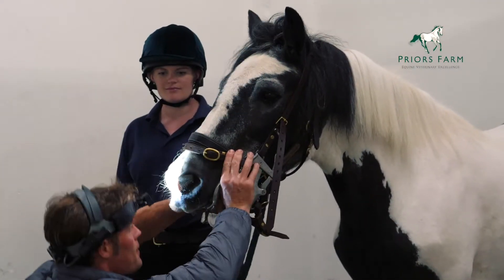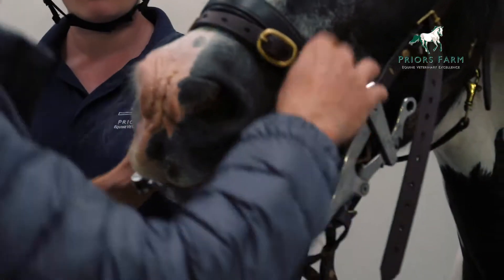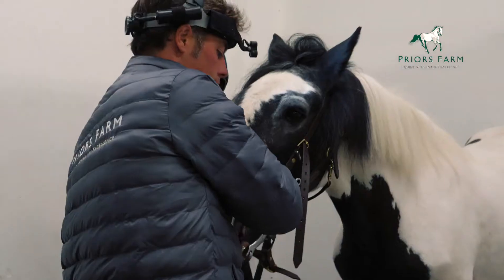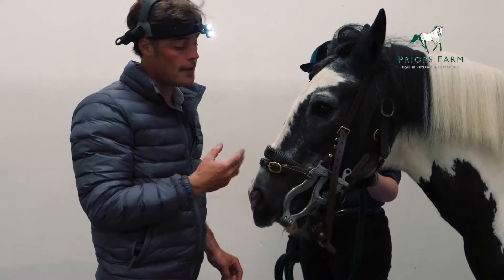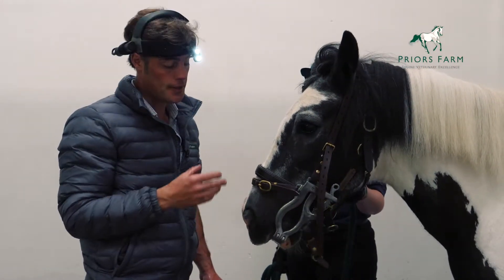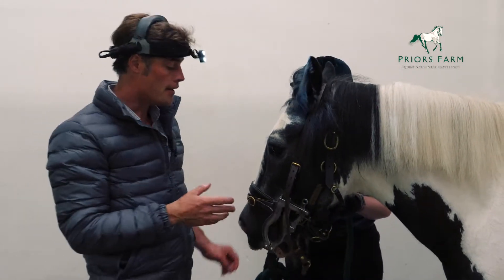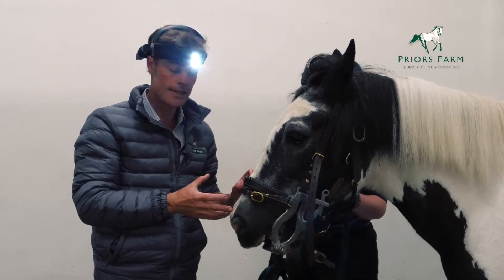Then we do a visual inspection of the mouth, followed by a digital inspection. At this point, we now know exactly what will be going on in the mouth. There are further things you can do if you're worried — you can use oroscopes, a small endoscope to have a look inside, dental mirrors, and dental picks as well. But for a basic routine examination, this would suffice.